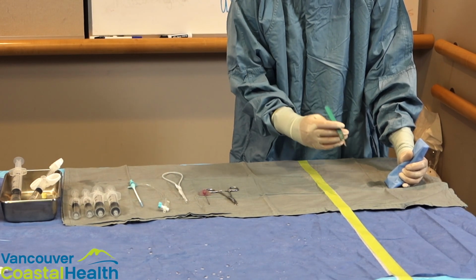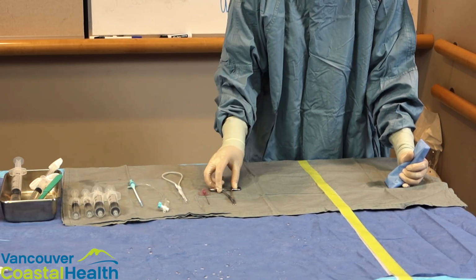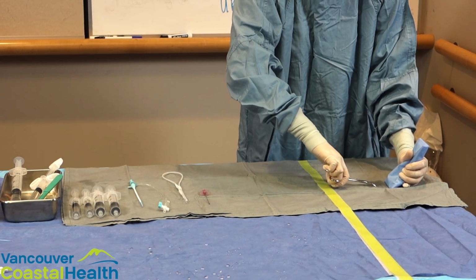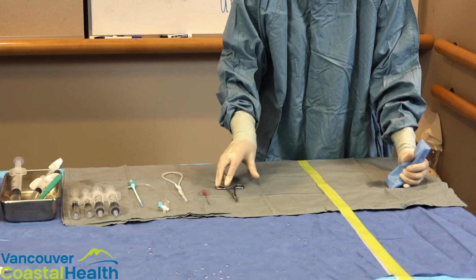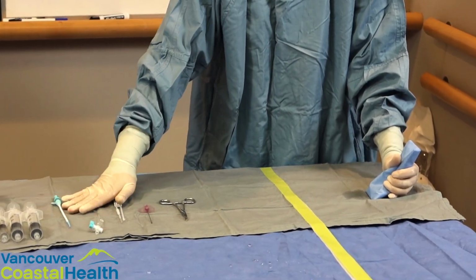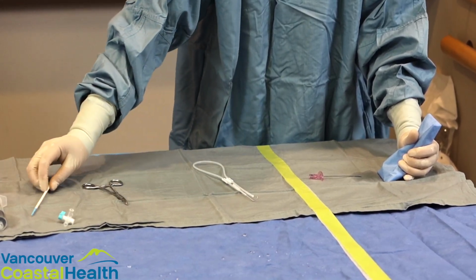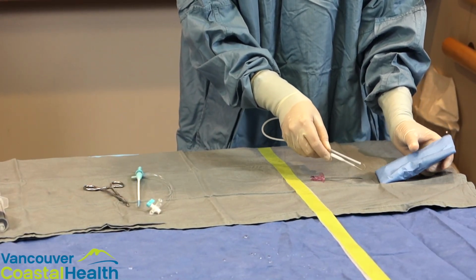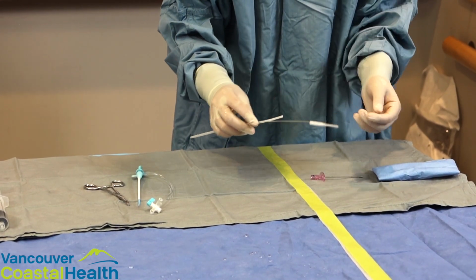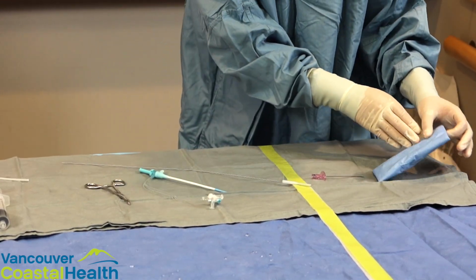Some physicians will choose to make a little bit of a skin nick, and once again, when they're done that, they'll place that into the sharps bucket. Some physicians will choose to do a little bit of a dissection to loosen the skin around this nick that they've made, and then they can place that aside. And then this is the part where if you are a scrub assistant that you can get the wire and the sheath ready. If a physician is working by themselves, they will just get it ready by placing it close to them, by having the wire straightened out using the cheater if that is something that they need, and having the sheath ready to go, everything within reaching distance.